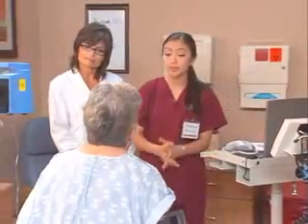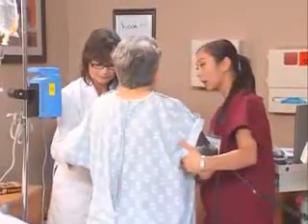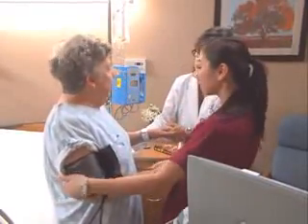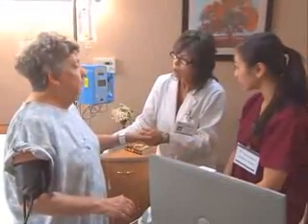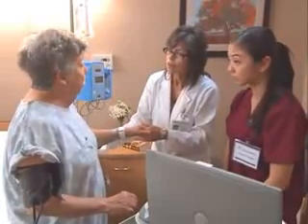Now we're going to try it again, standing up this time. We'll see. Do you feel up to standing? I guess so. Well, if you're not sure... No, I'll try it. Okay. How do you feel? Not too bad. You can do what you have to do. All right, well, we need to wait another 2 or 3 minutes. Are you feeling okay? Are you feeling dizzy or lightheaded? No, I'm okay.